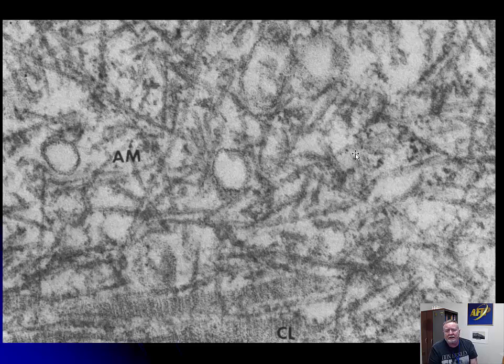But on EM, and we're probably in a glomerulus here, it could be in a liver or something, you can see this material expands and pushes everything out of the way, but it's very loosely arranged. So I think those are three fibrils that you probably should be able to recognize. Like everything else in ultrastructure, it's based on a lot of considerations, including hopefully knowing where you are. And if you're in the glomerulus and this was a dog who was proteinuric, sure, you see something like this and say, yeah, okay, we've got amyloid.